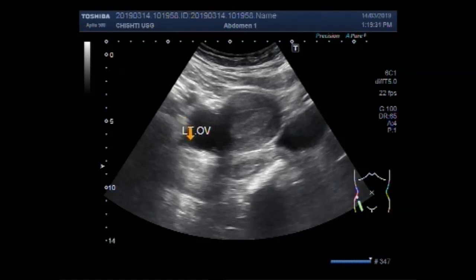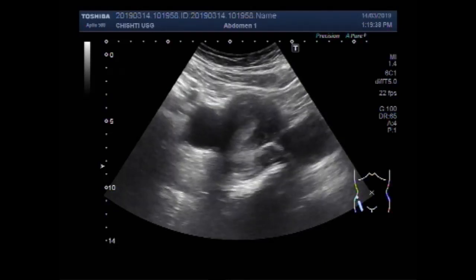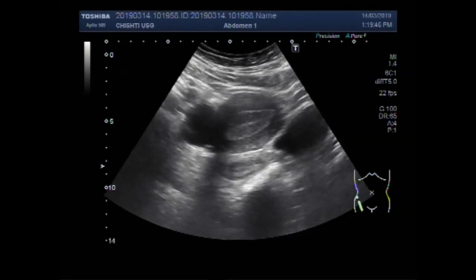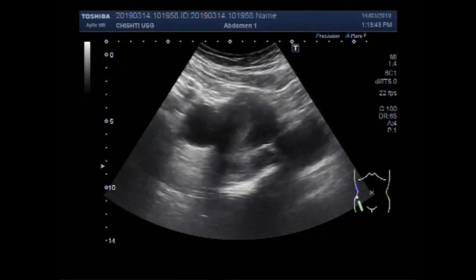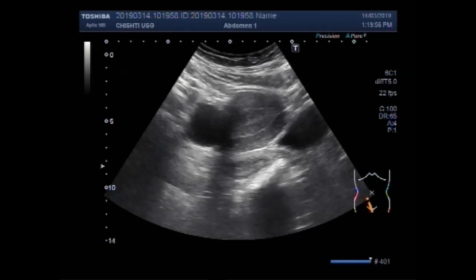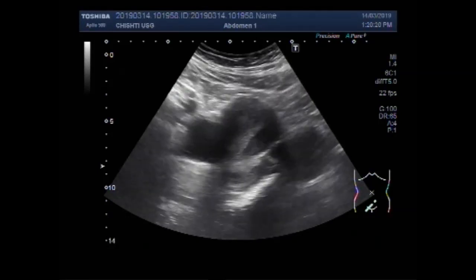And this one is the left ovarian cyst. Now you can see an evenly echogenic area in the distal portion of the uterus — in the middle and distal portion. This one is the left ovarian cyst, and it measures about 36.9 mm by 36.9 mm, almost round to oval in shape.